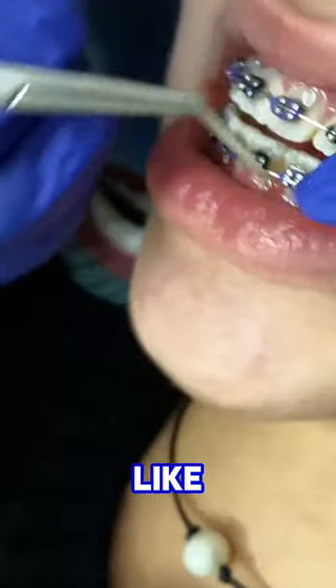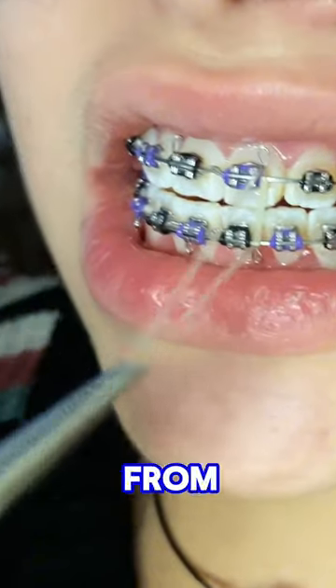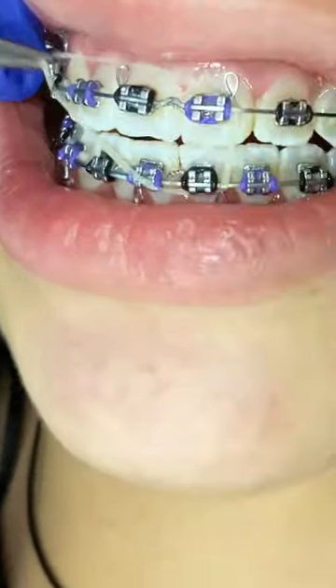The bottom teeth have little hooks that stick up, and those are used to attach the rubber bands. The first elastic goes from the upper left one tooth to the bottom left one tooth, then to the upper right three to the lower right three.